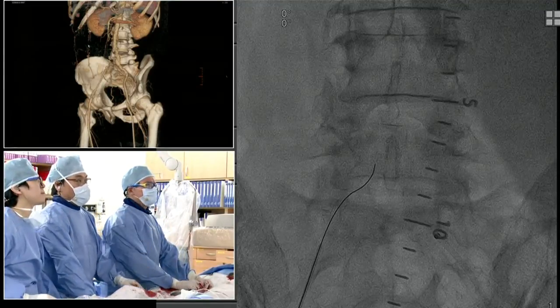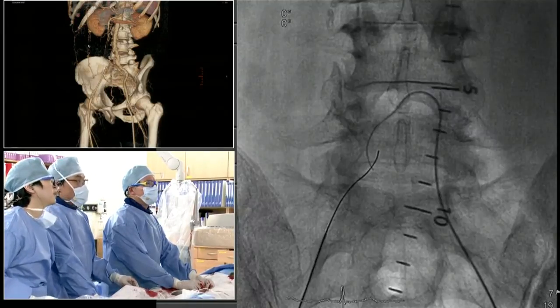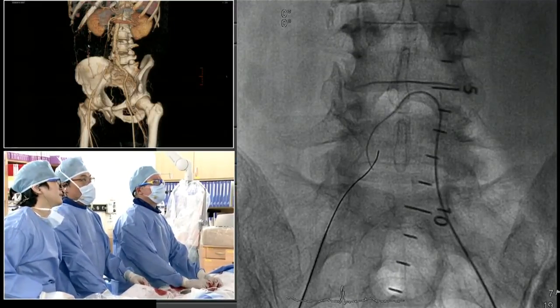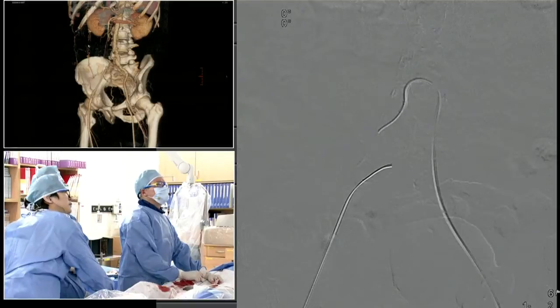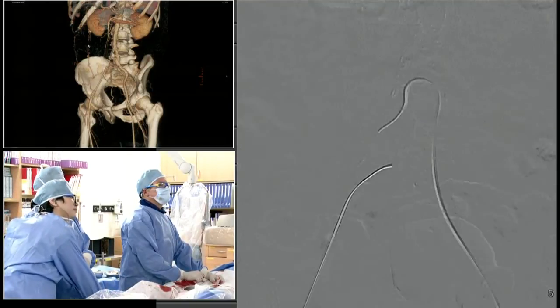Go a couple shots back. John, freeze this particular shot. That's good. Reconstitution of the external iliac. Put it upstairs, please. If the external was occluded, how far down would you still be okay with trying the case with endovascular means? How much of an external occlusion would you still deem as okay?